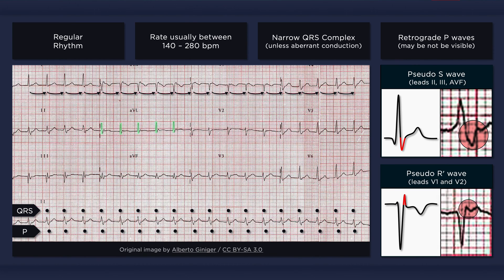In leads V1 and V2, the terminal deflection can result in what looks like an R wave. This ECG reveals both pseudo-S waves in lead II and pseudo-R prime waves in V1. In sinus rhythm, however, none of these appendages should be present.